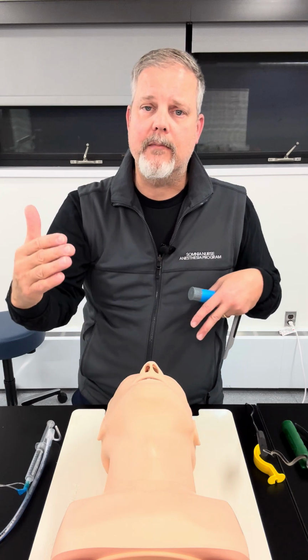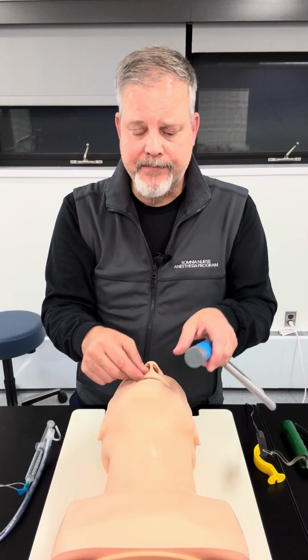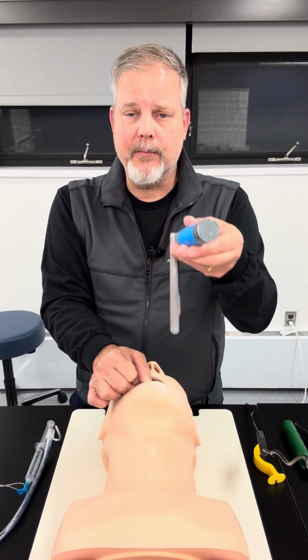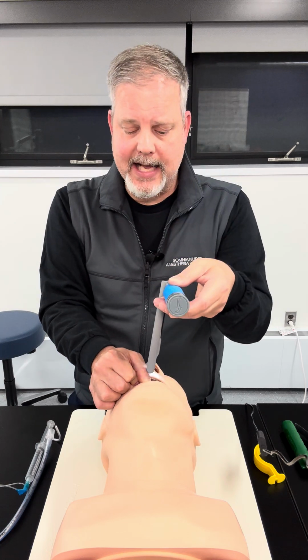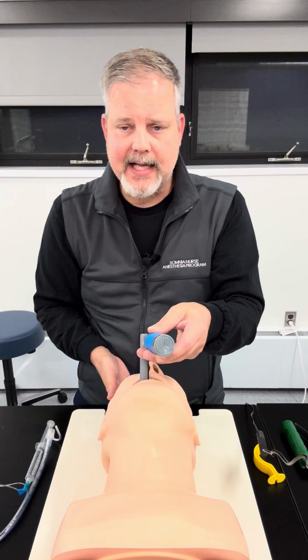And what I'm doing is putting it in their teeth so I can open the mouth up wider to be able to get this blade within that mouth without hitting the teeth or causing major damage. So now I have scissored the mouth open. Then I'm going to take my blade and slide it in the mouth over on the right side. I'm going to keep sliding it down.